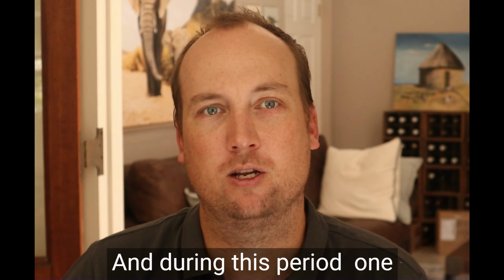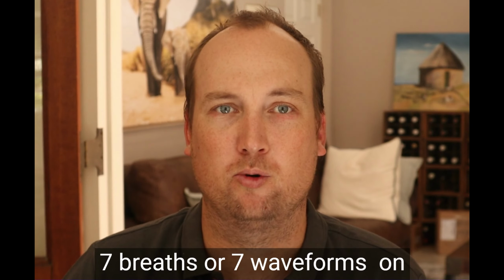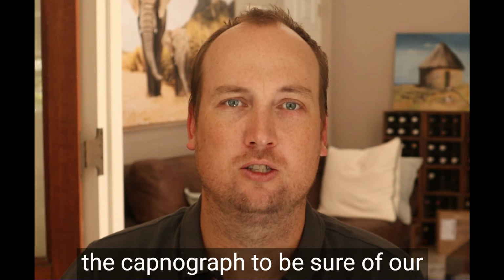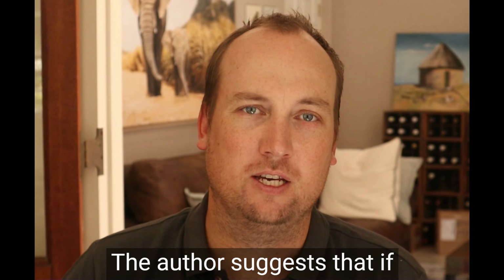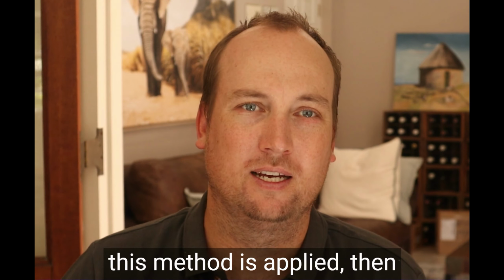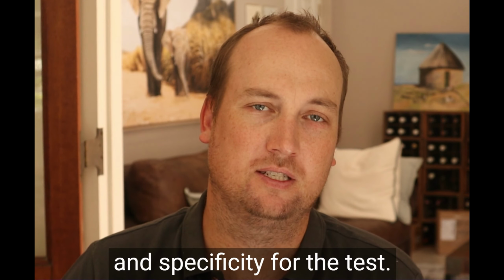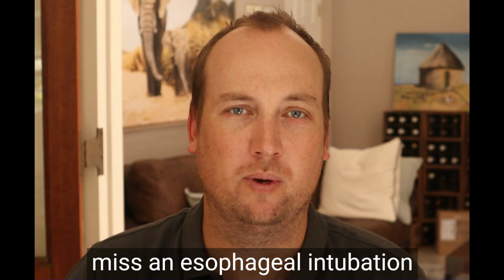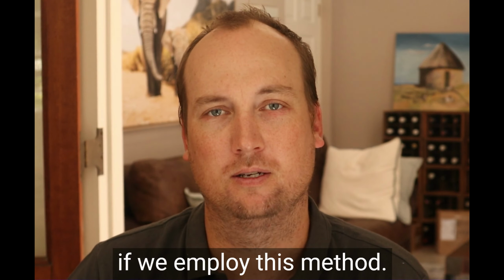During this period, one needs to observe a minimum of 7 breaths or 7 waveforms on the capnograph to be sure of our endotracheal tube placement. The authors suggest that if this method is applied, then there is 100% sensitivity and specificity for the test. This means that one will never miss an esophageal intubation with the endotracheal tube if we employ this method.